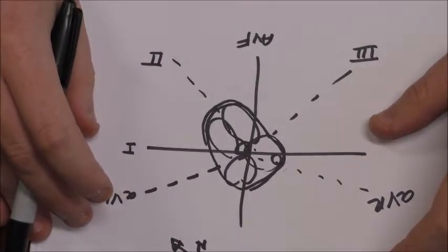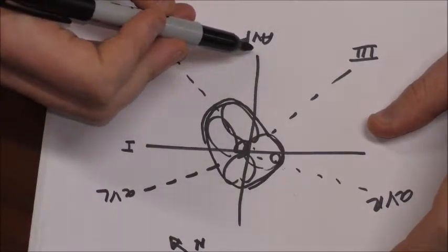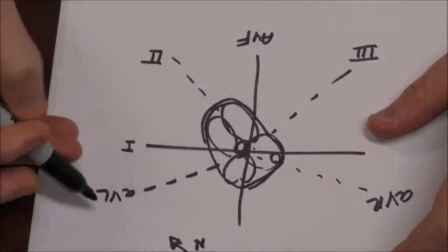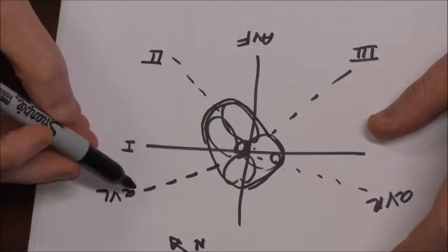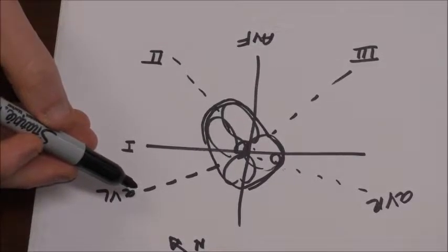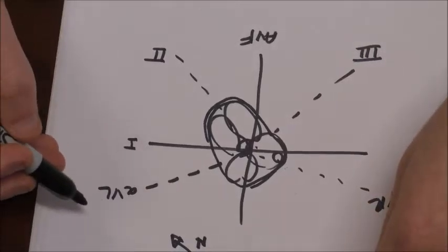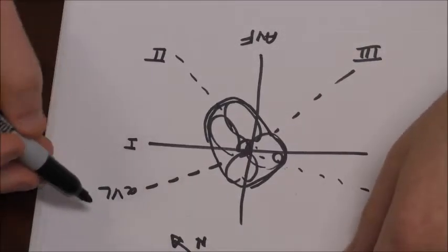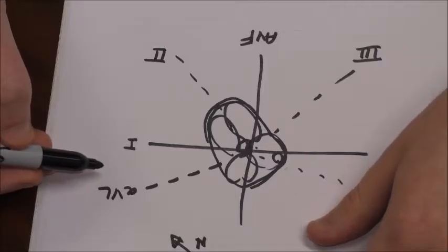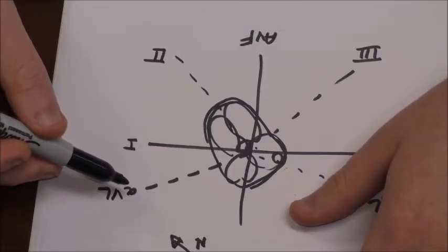And they say, based on diagnostic criteria, anything that falls outside of AVF or lead 1, or some people say AVL, would be considered an axis deviation. So most people don't really understand this. They kind of use the method of looking at the EKG itself and say, well, 1's positive and AVF is positive, then it's normal axis. Well, what does that actually mean?